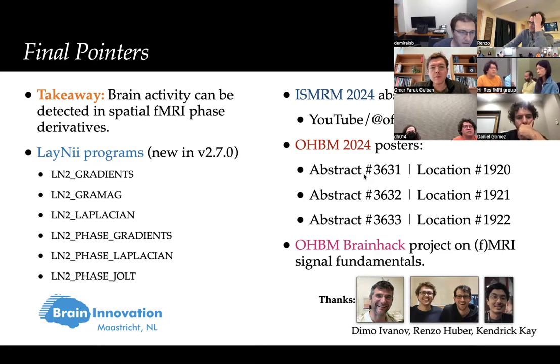Yeah, thanks for the three questions. So first one, how to extract phase data from the scanner. I think you just need to change one parameter to make it export magnitude and phase data. I don't remember which parameter it was in the console. Okay, since we have the DICOMs from the magnitude, we cannot reconstruct it now, right? We have to do it in the beginning. Yeah, if you only have magnitude DICOMs, it means you have put your phase data into the trash bin already. Right.